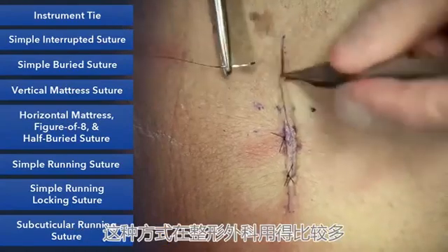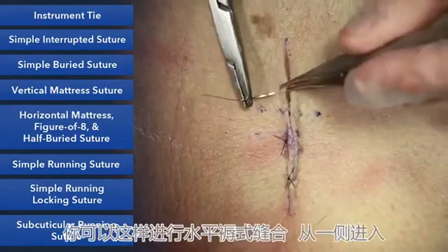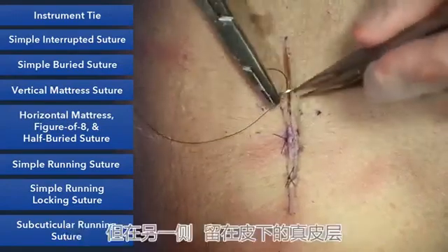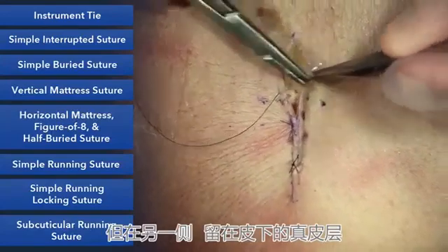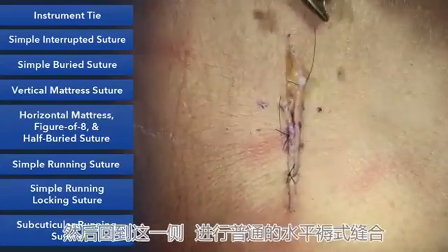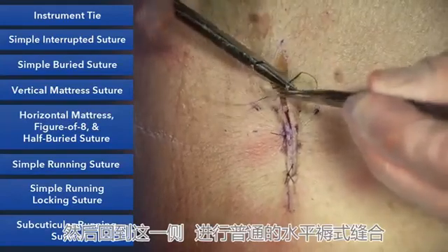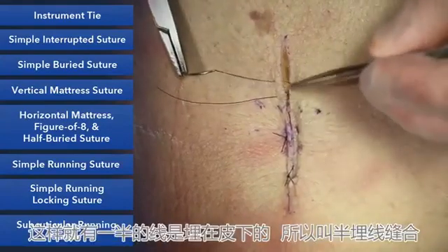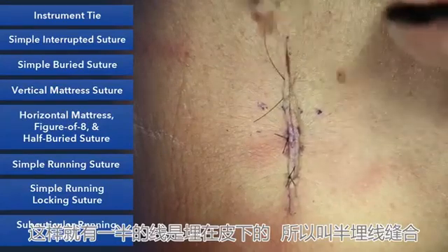And we use this a lot in plastic surgery. If there's an area where you don't want suture holes, you can actually start your horizontal mattress on one side, on the opposite side, stay within the dermis in a horizontal fashion, in a subcuticular fashion. And then come back on the other side, again out like you would in a normal horizontal mattress. So effectively it's your horizontal mattress, but half of it is buried, hence the name, the half-buried horizontal mattress.